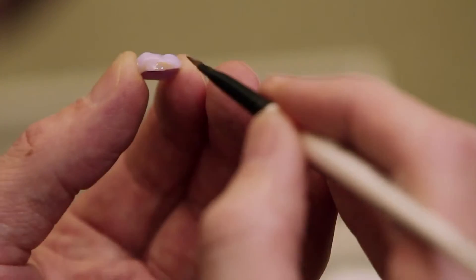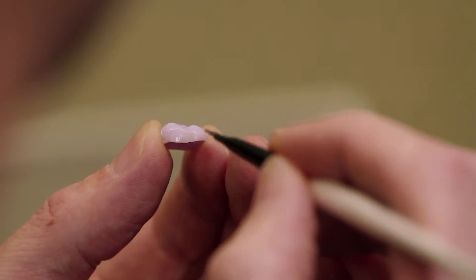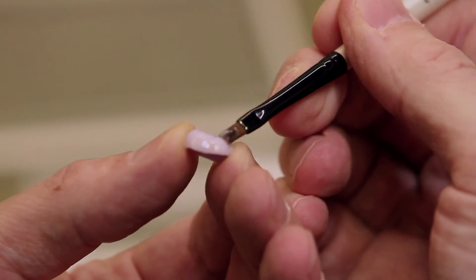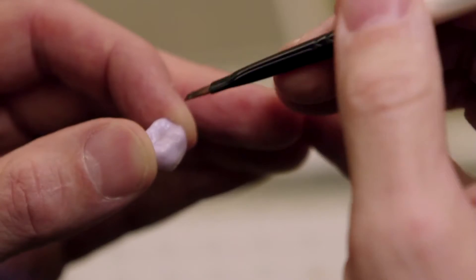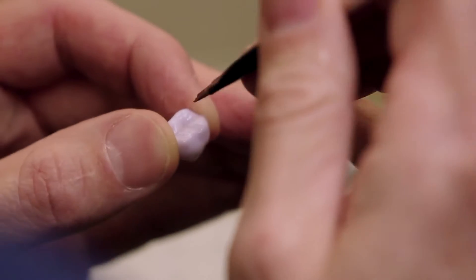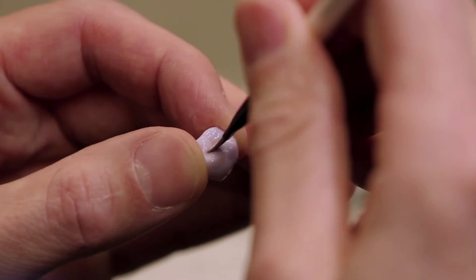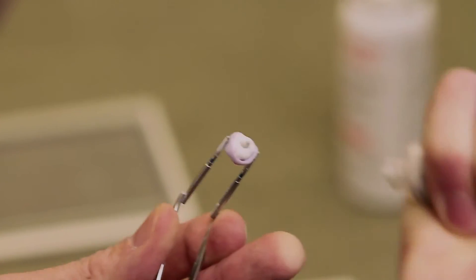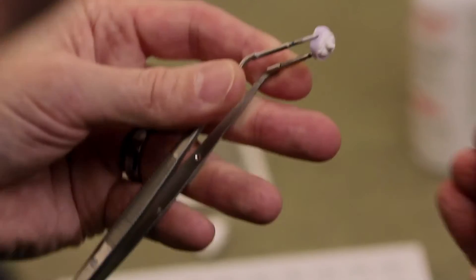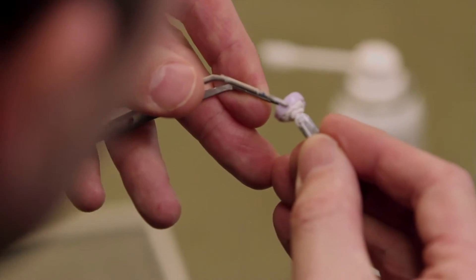We put stains in to characterize the gingival third — if you can see it, it's almost too much. This is going to give us our gradation of color that we need. For the occlusal, all I do is run a little bit of stain through the isthmus so you can barely see it — it shows that there's a slight bit of dimension there. When we put this in the oven, it goes from lithium metasilicate to lithium disilicate, and we have to have our margins supported or the crown may not fit as well.